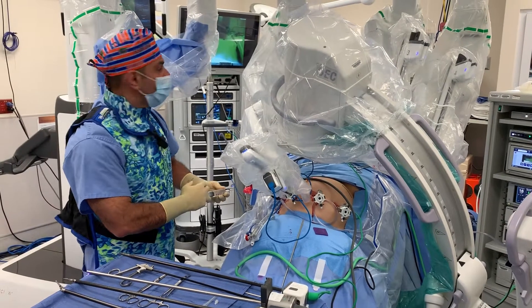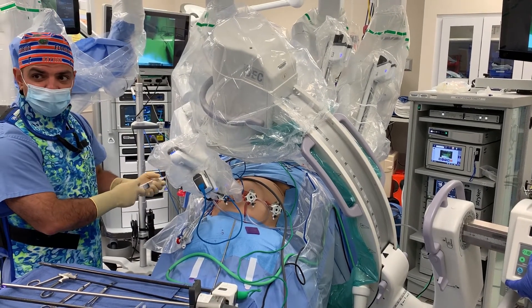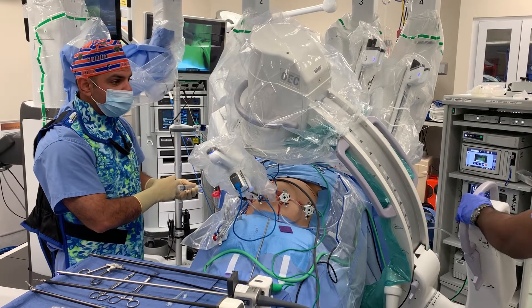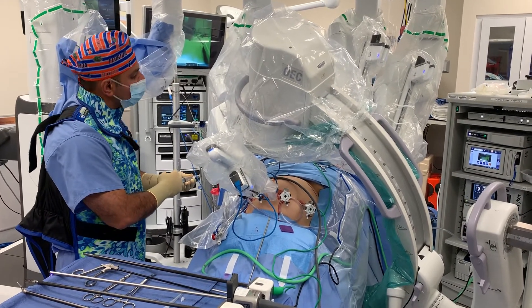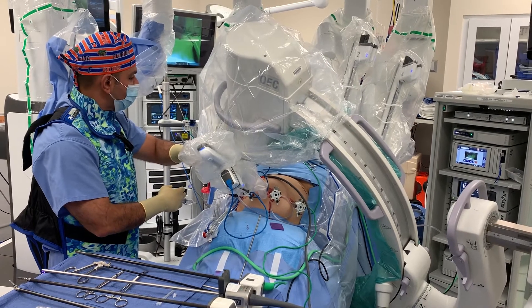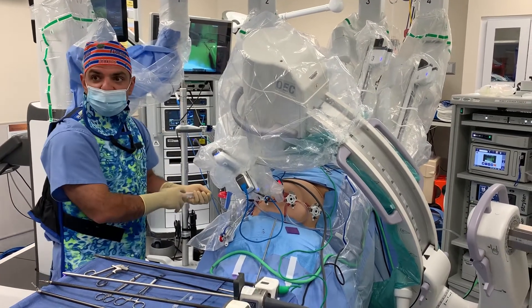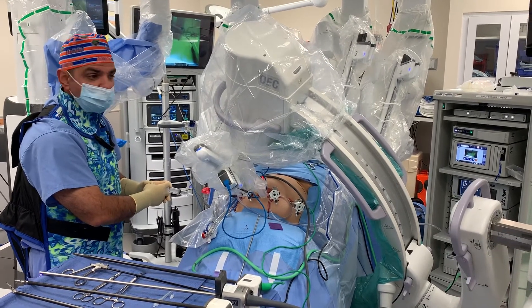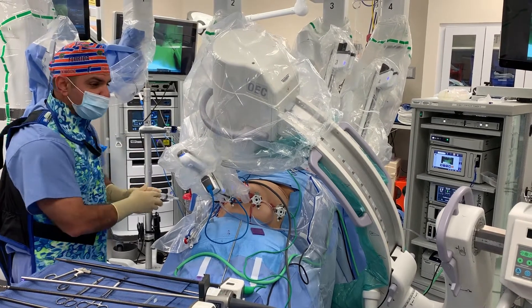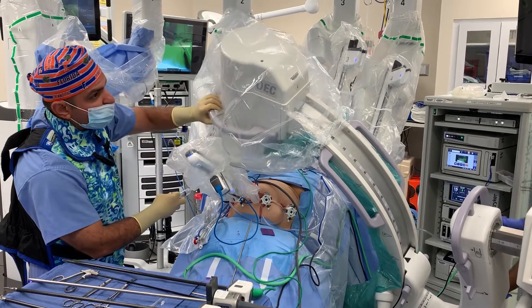I'm essentially guiding the fluoroscopy machine in and priming the catheter as well as the bile ducts. Here I'm actually looking at the screen to make sure that I get a good shot of the entire intra- and extrahepatic bile ducts and make sure that there's no filling defect at the ampulla of Vater.